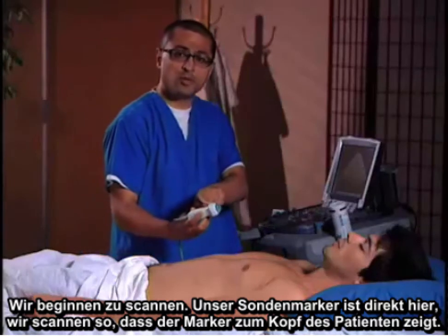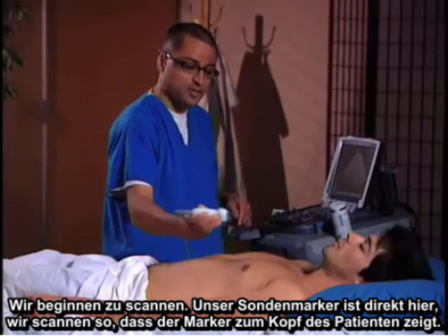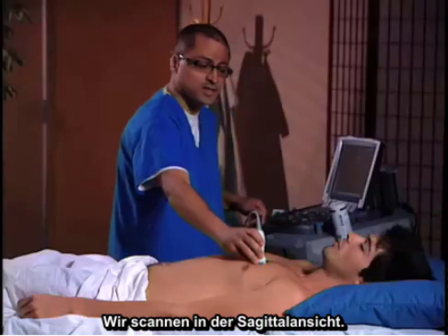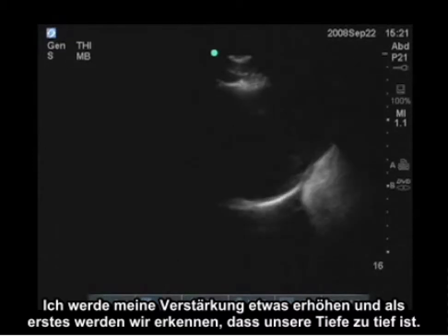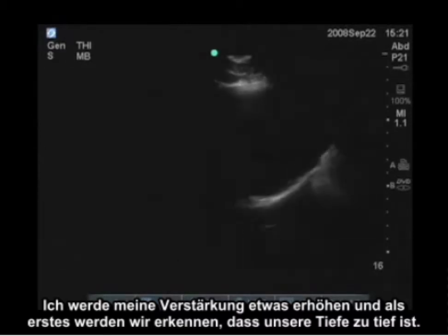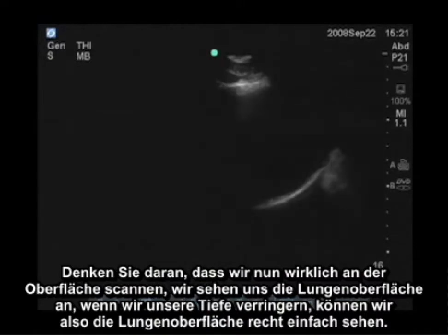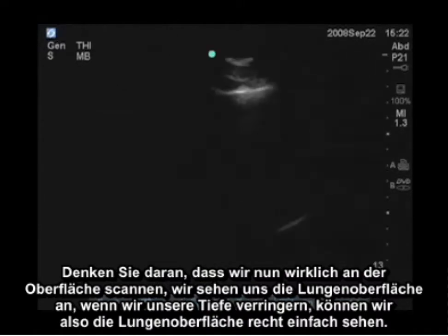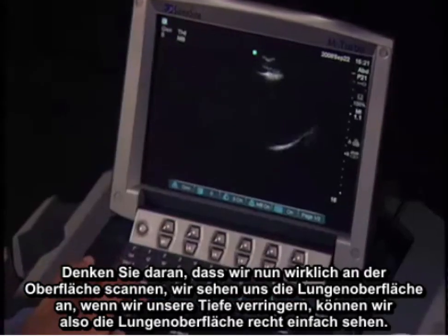Here's our probe marker. We're going to aim that toward the patient's head and I'm scanning in a sagittal fashion. I'm going to turn my gain up a little bit, and first we're going to recognize that our depth is too deep. Remember what we're scanning now is really superficial — we're looking at the lung surface. So I'm going to decrease our depth so we can see the lung surface quite easily.